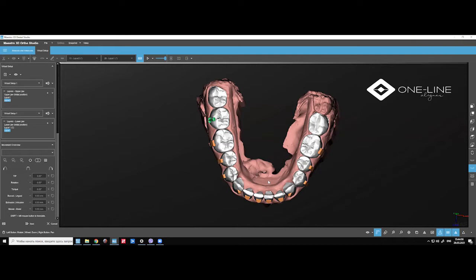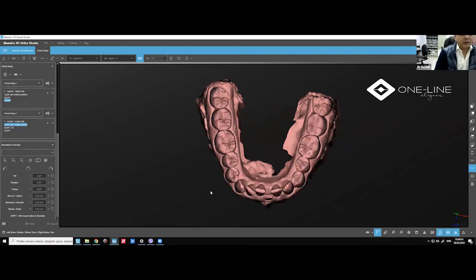What do you think about a thickness of around 1 millimeter? I tried, but no. In this case, for example, you cannot use 1 millimeter. If you use 1 millimeter, it's too thick. The patient cannot take it out, and it's very, very painful for the patient, and some of the teeth in the beginning. So let's see this patient, right? If you are here, the 1.0 will not even enter. It's too crowded for the arch to enter. So 0.75 3-layered, which is very, very flexible, is a good thing.